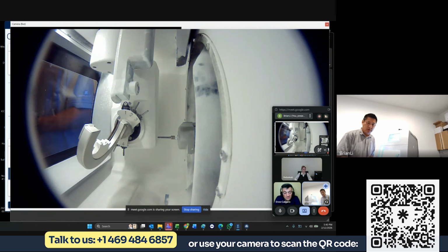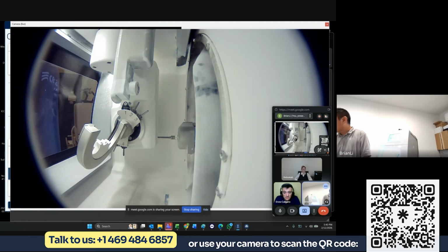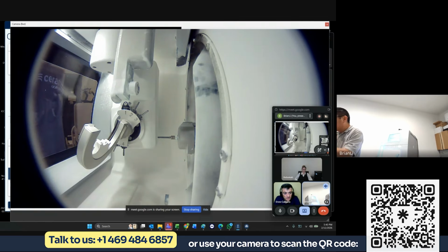Okay, should we go to the other mill? Yes, sir. Sure. All right. So we're going to jump to another room.